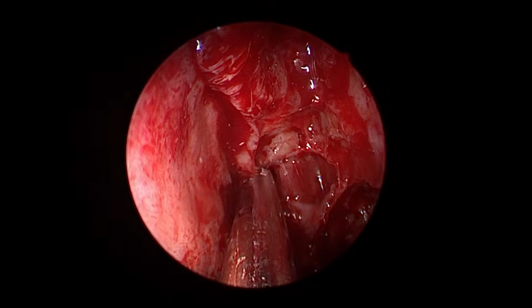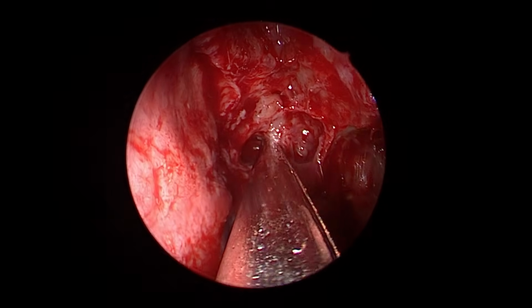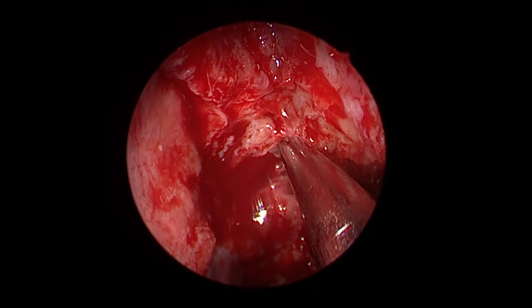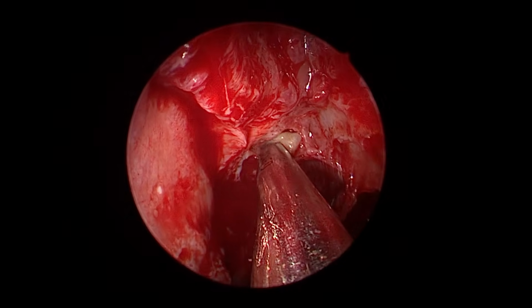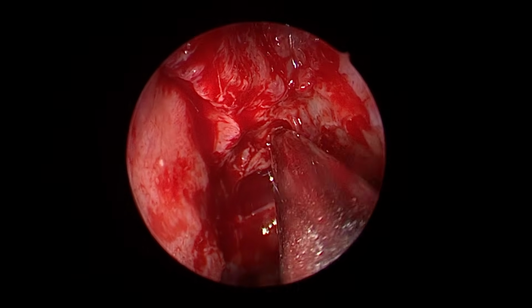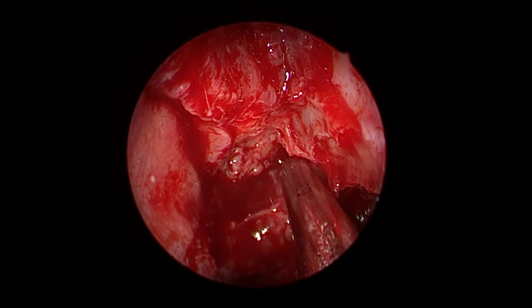Sir, how to find out the anterior ethmoidal artery? Depending upon the CT scan, how prominent it is. It is not mandatory to go for it. But yes, to prevent complications, the best way is positive identification. So if there are more pneumatized sinuses, thinner walls, a more prominent artery, you have to be more careful. That's it.